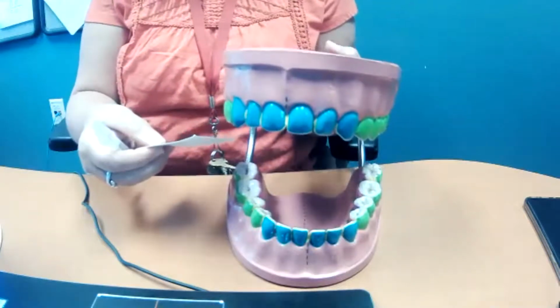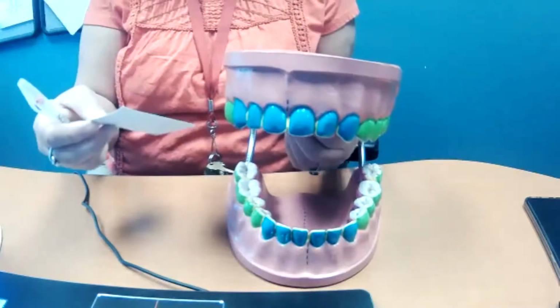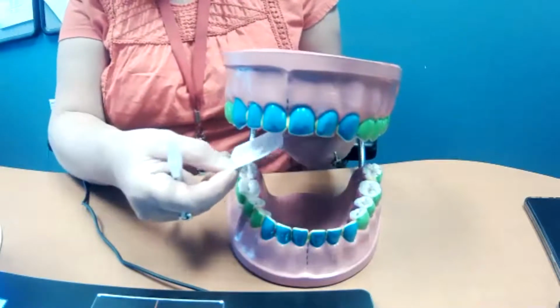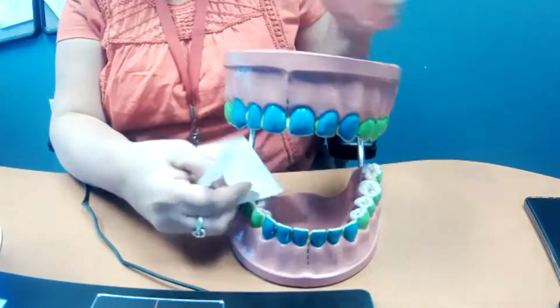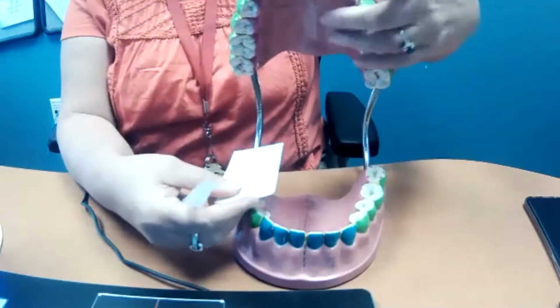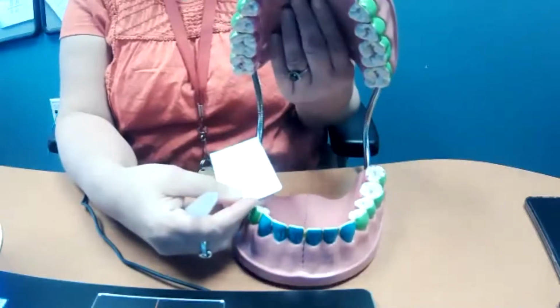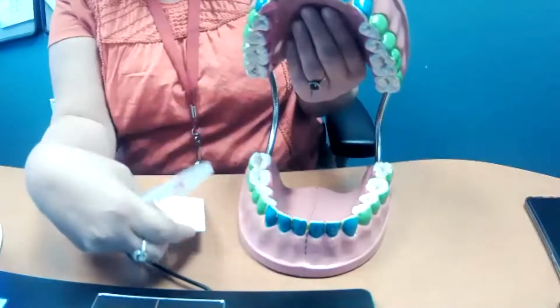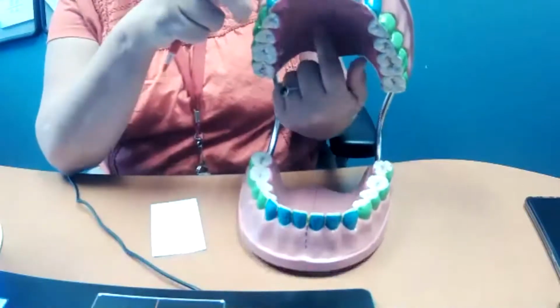And one of the main things that we talked about, or that chapter 17 talked about, was the angulation and how important it is to make sure that you put the film far enough into the mouth or away from the teeth. And I had mentioned that on the maxillary, the big problem is that your palate does not move, right?